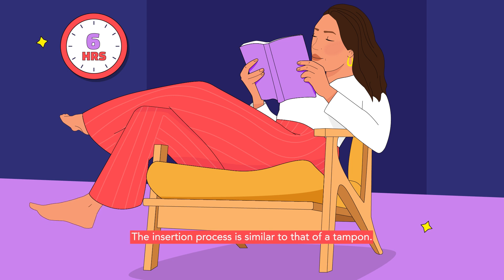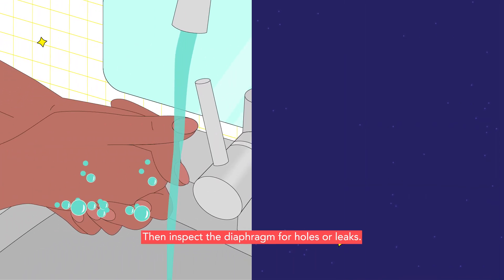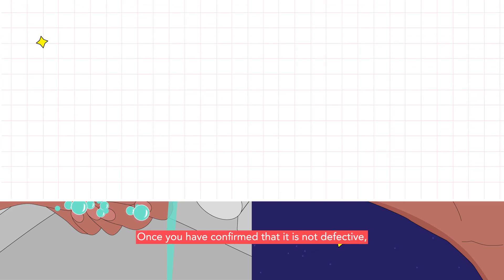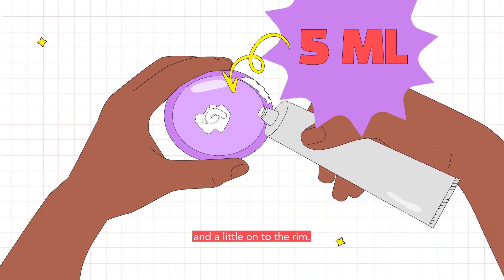The insertion process is similar to that of a tampon. Firstly, thoroughly clean and dry your hands. Then, inspect the diaphragm for holes or leaks. Once you have confirmed that it is not defective, measure five milliliters of spermicide and apply it onto the inner surface of the diaphragm and a little onto the rim.